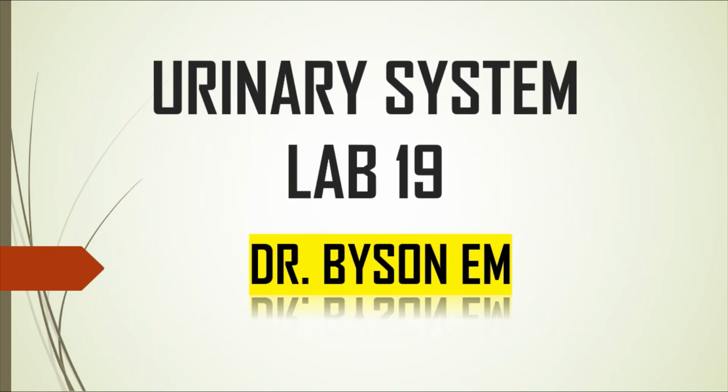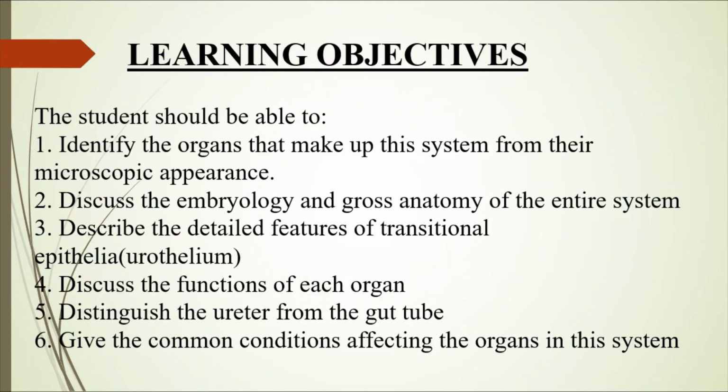Today we're looking at the urinary system, which is Histology Lab Practical Lab number 19. Okay, let's get into what we're looking at today.